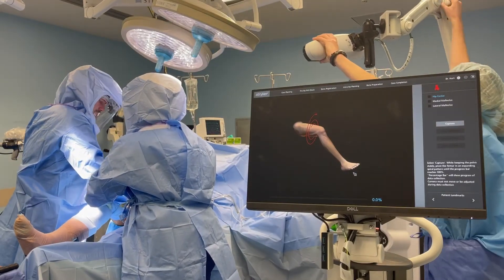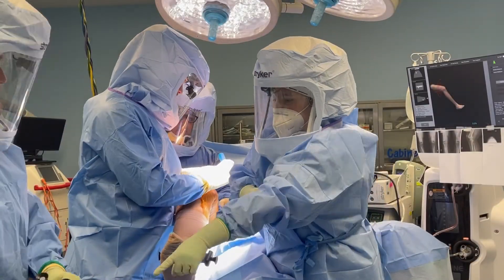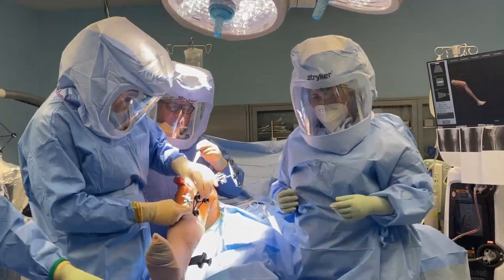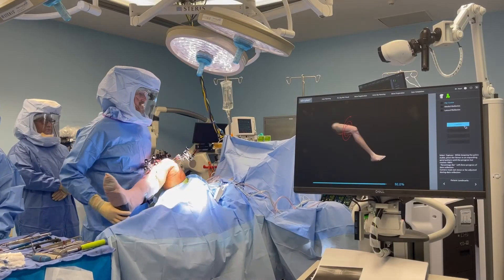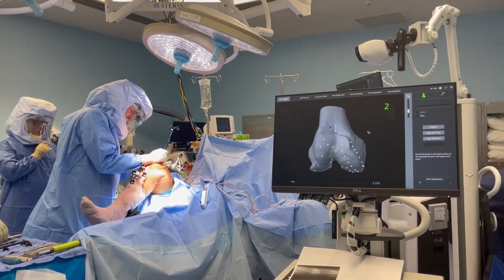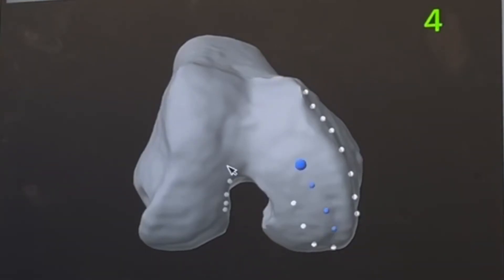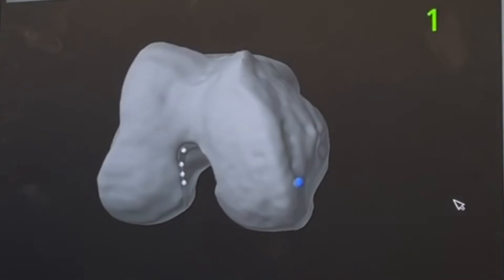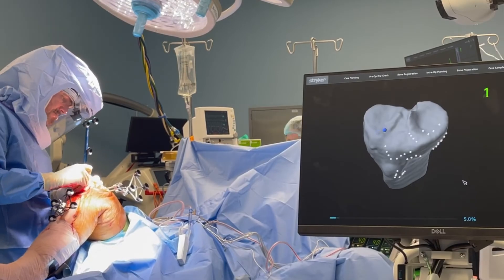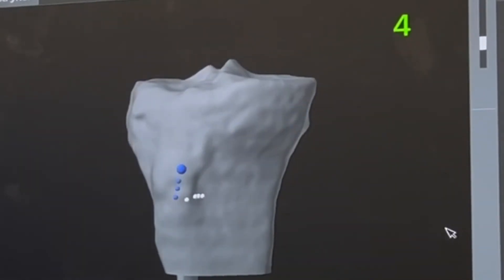Here's actual surgery sped up. After I open the knee, the first thing I do is attach the jigs so the robot knows where the femur and tibia are in space. Then I rotate the hip to find the hip center, touch the ankle edges, and go through and touch various points on the femur and tibia in a registering process so the robot knows exactly where the knee is. This is a very precise procedure, custom for every single knee. The CT scans you're seeing are the actual CT scans of the patient — that's why you get a CT scan prior to surgery, so we can map it and prepare it for your particular case.